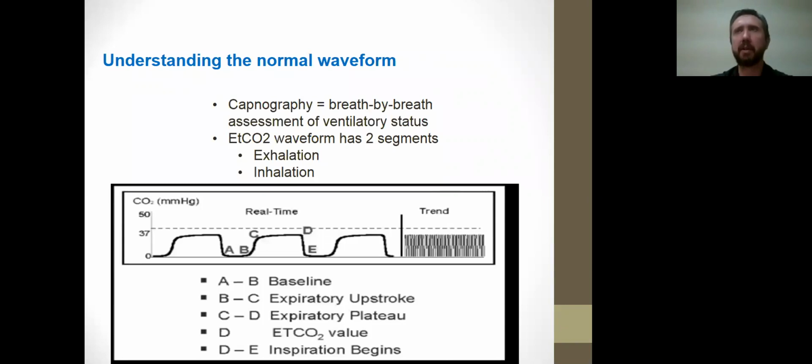So in other words, it can be concluded that the height and slope of the alveolar plateau is dependent on ventilation, cardiac output, and more importantly on the VQ relationship. It can also mean that there may be an uneven distribution of the exhalation of CO2, which would give it that shark fin shape in reactive airway diseases. Okay. All right.